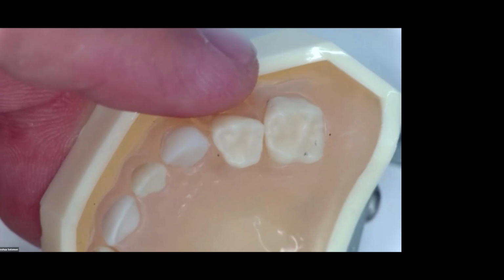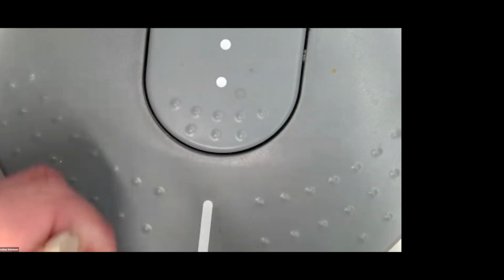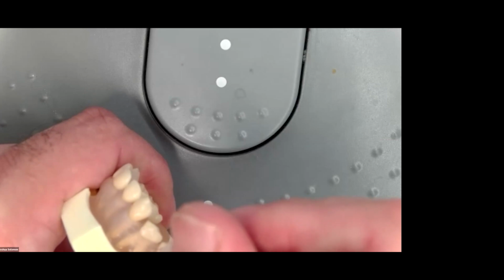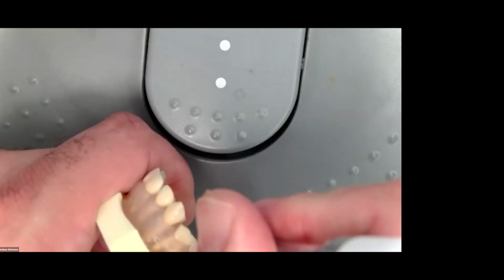So we just had a question pop up as well. Are you injecting anesthetic while pushing into the bone? So as you're going through the 3 steps, right. I don't know if you can zoom out a little bit more, maybe show the foot pedal. Yeah. So am I injecting while I do that? No. It really is 3 separate stages. So it's 15 degrees, waiting for it, getting that blanching papilla, changing your angulation, and then manual bone penetration, and then stepping on the pedal.